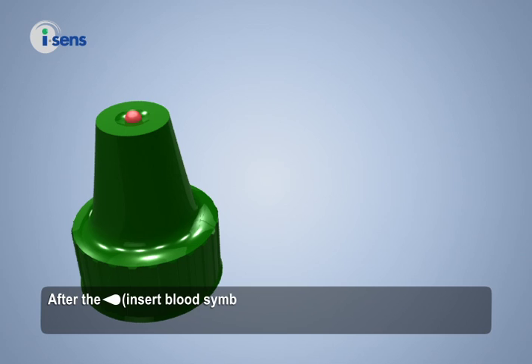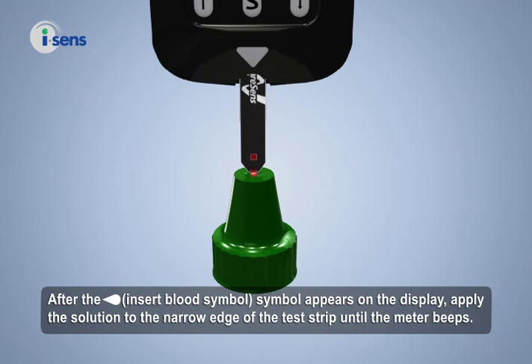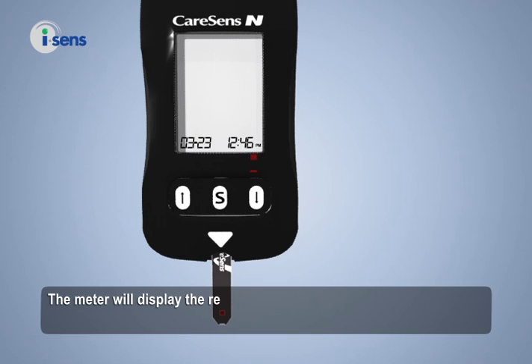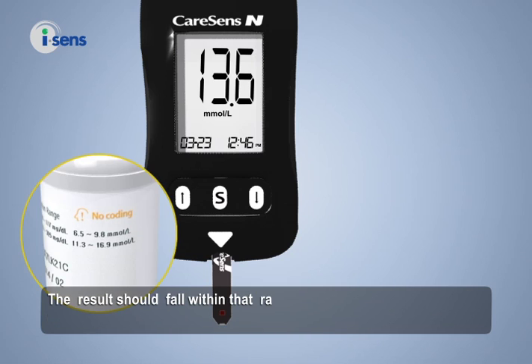After the insert blood symbol appears on the display, apply the solution to the narrow edge of the test strip until the meter beeps. Make sure the confirmation window on the strip is fully filled. The meter will display the result after counting down from 5 to 1. Compare the result displayed on the meter to the range printed on the test strip vial — the result should fall within that range.